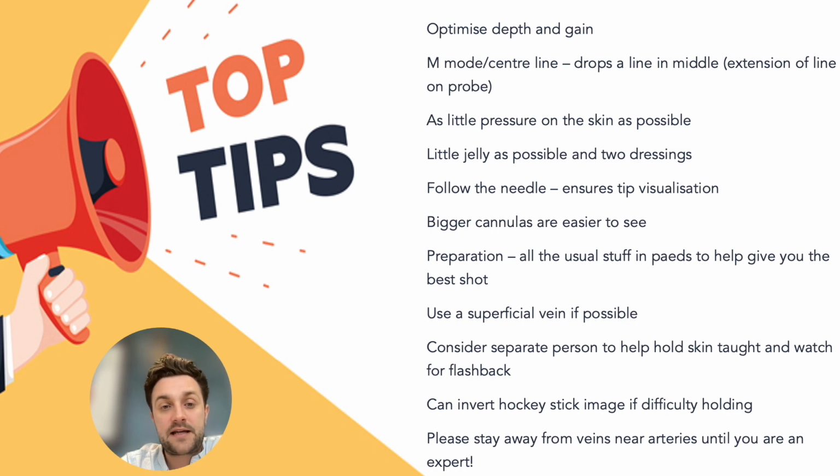Use as little jelly as possible. Okay, obviously we need jelly for the ultrasound to work, but afterwards we've got to stick down the dressings to keep the cannula in place, and the more jelly you have, the more difficult this is. So make sure you don't pull out the cannula whenever you're getting rid of the jelly, and sometimes two dressings if it's particularly difficult is useful. So one the normal way and then one at 90 degrees.